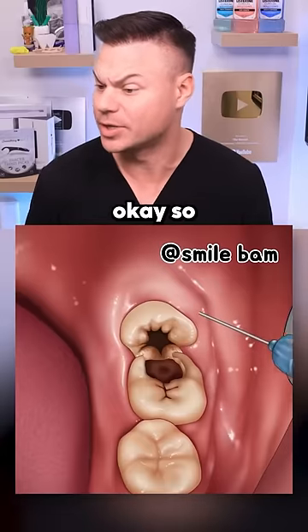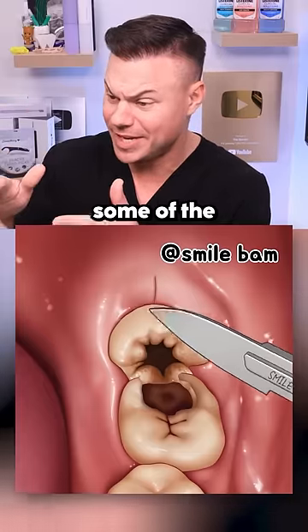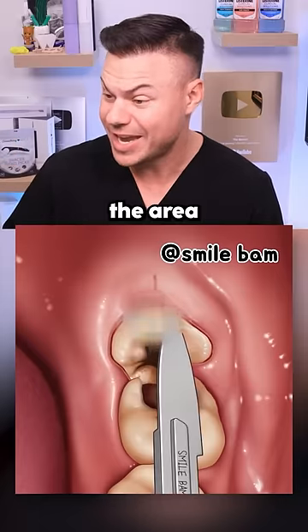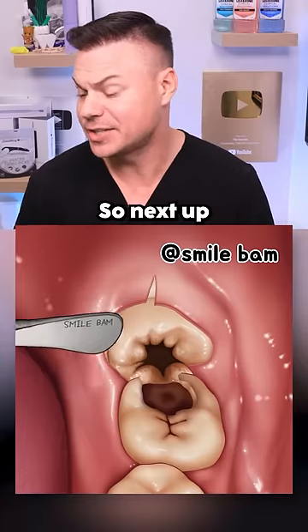Apparently you guys love it when I do these videos. Looks like we have an impacted wisdom tooth. They put in some of the numbing medicine, and obviously they have to kind of remove the area of tissue where that wisdom tooth is hidden in there.